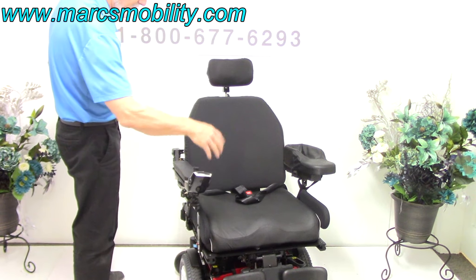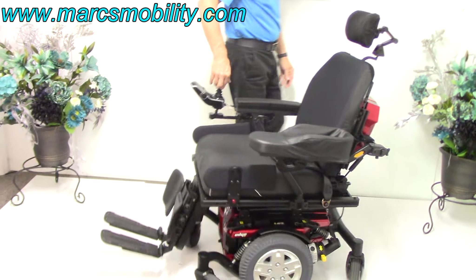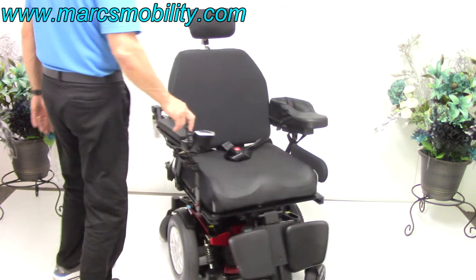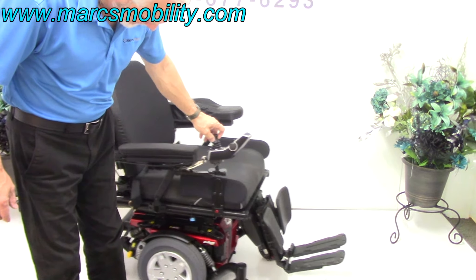This is a mid-wheel drive chair, so it drives from the middle. The turning radius allows it to turn all day long within its own length — it can spin in place wherever it's at.